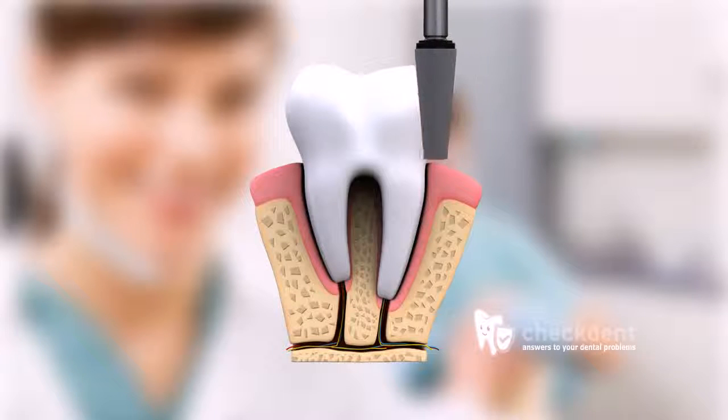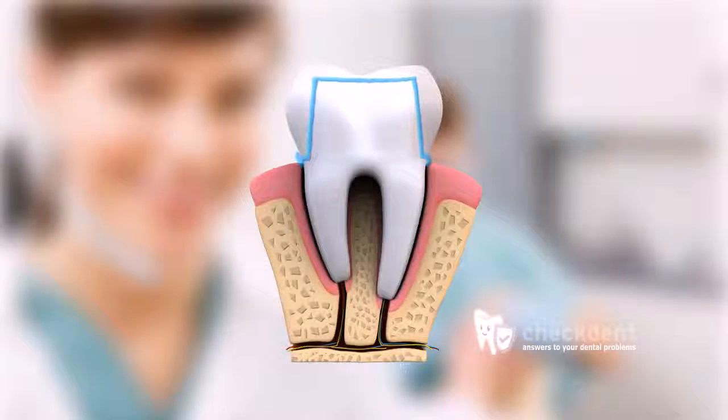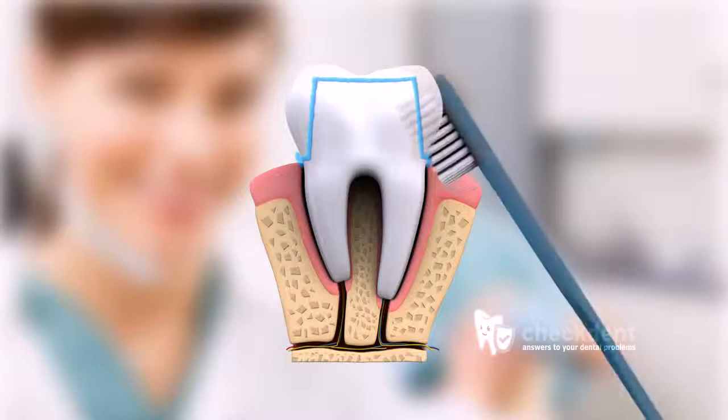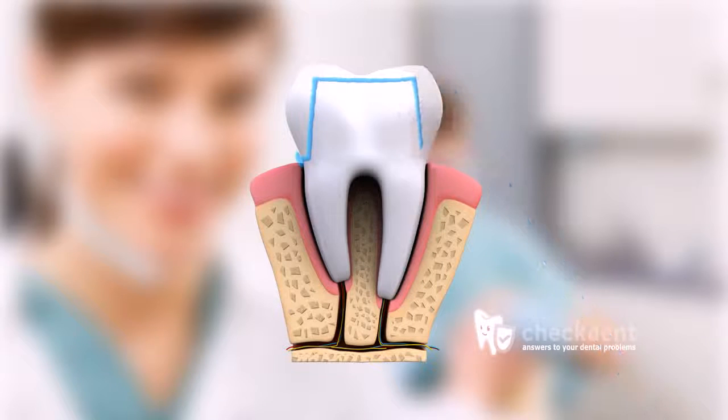Another possible technique for crown cutting is the so-called stepped abrasion. This is also a relatively quick process. Unfortunately, the adhesive does not flow very well during cementation, creating a wide joint in the glue. As a result, there is a risk the adhesive, usually cement, can get washed away with time, for example by brushing. This will once again increase the risk of root caries.